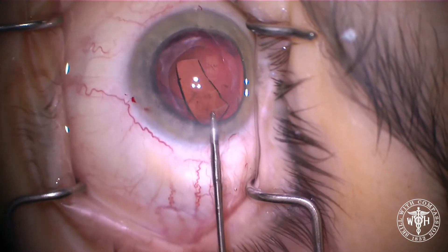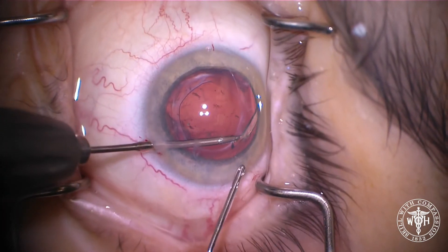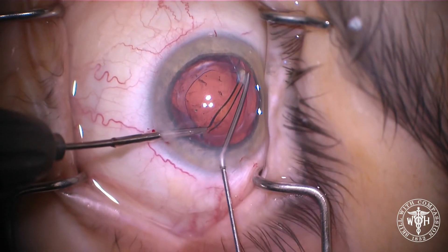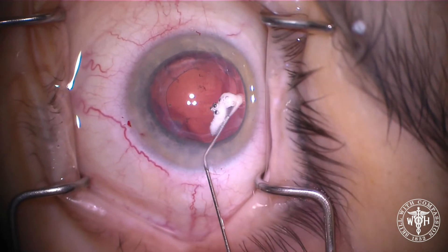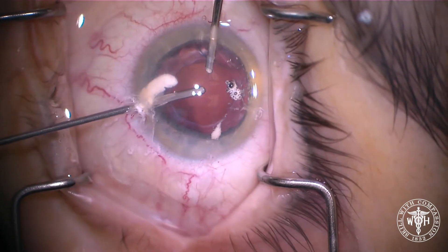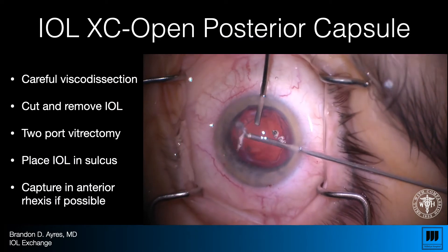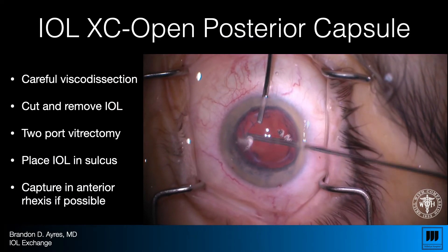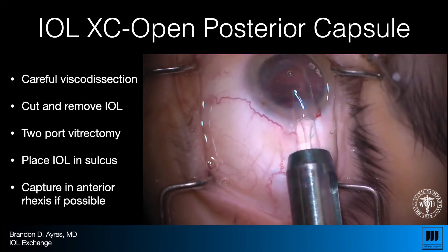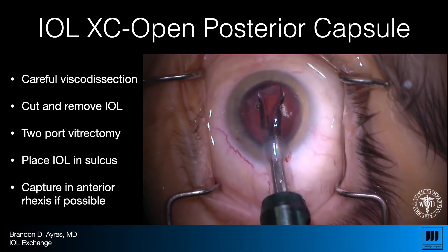We remove the optic — getting it out of the way opens up surgical angles we didn't have before. We grab onto that optic enshrouded in capsule and carefully visco-dissect it off. With an open posterior capsule, we need to do a vitrectomy. I like to put in a little triamcinolone and always do a two-port vitrectomy in these cases, sometimes a pars plana vitrectomy. I strongly encourage triamcinolone so you can really see where the vitreous is. Then place the IOL in the sulcus.